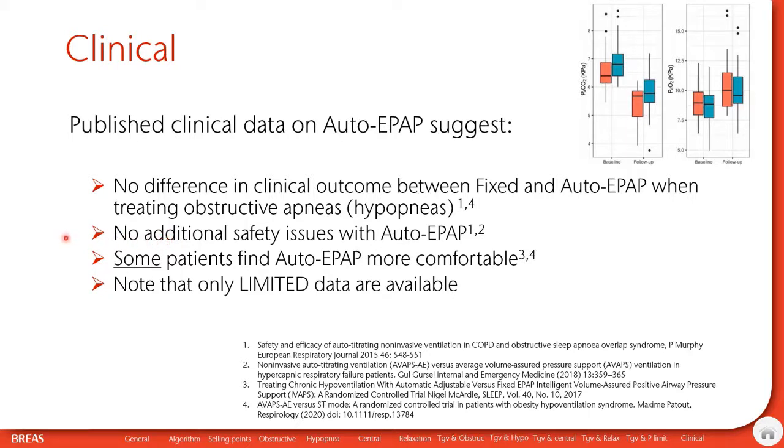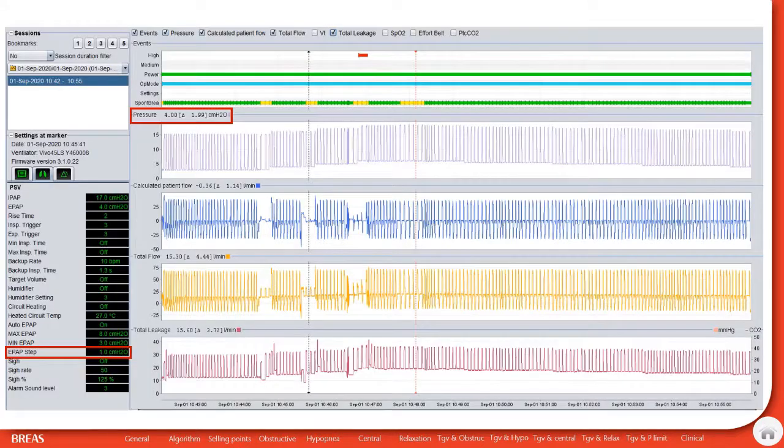No additional safety issues have been found, and in some of the reports the patients indicate that Auto-EPAP is a bit more comfortable. But it's important to know that there's only limited data available as of today on the usage of any Auto-EPAP algorithm.